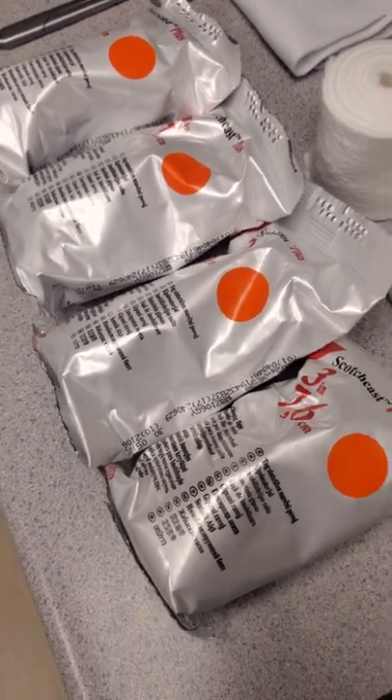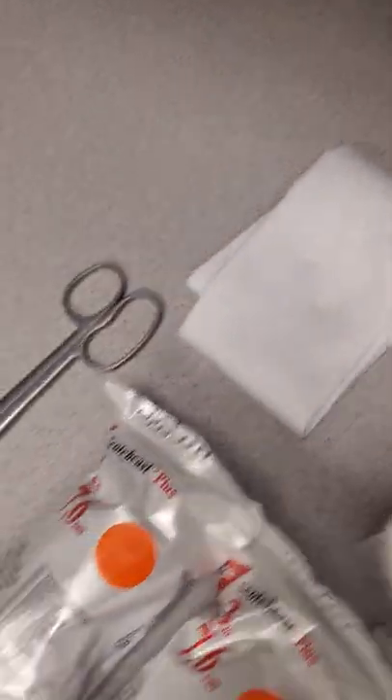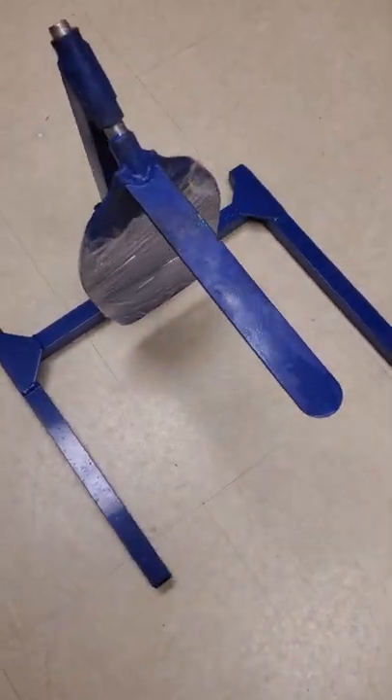Standard 3M fiberglass cast material, web roll, cast padding, stockinette, safety scissors, and of course the one main thing requested: the cast stand.